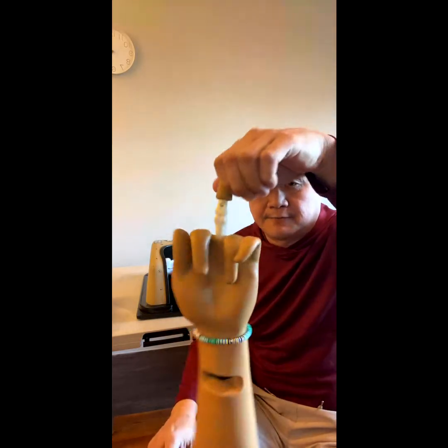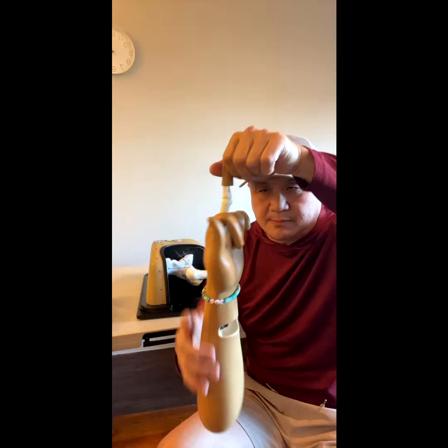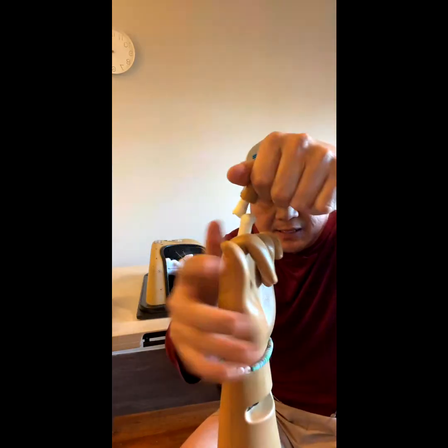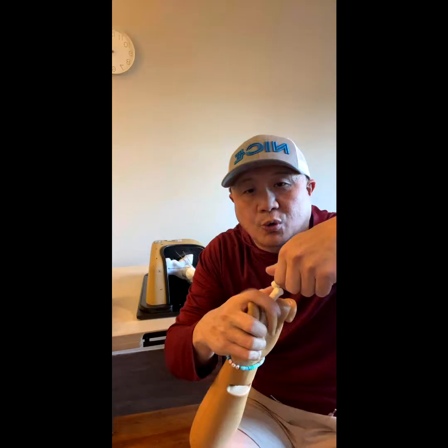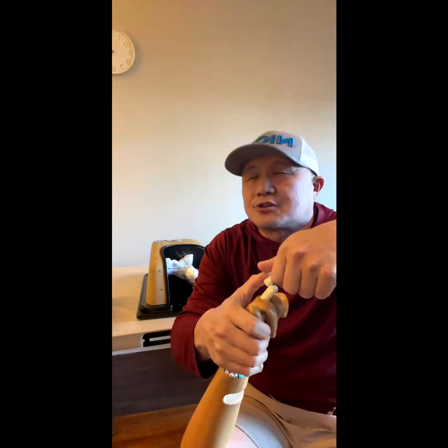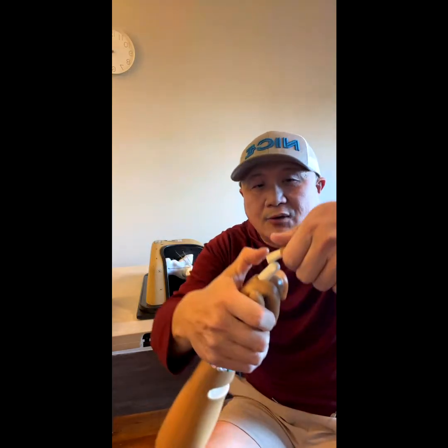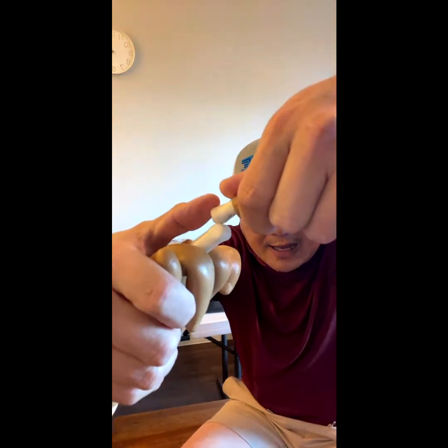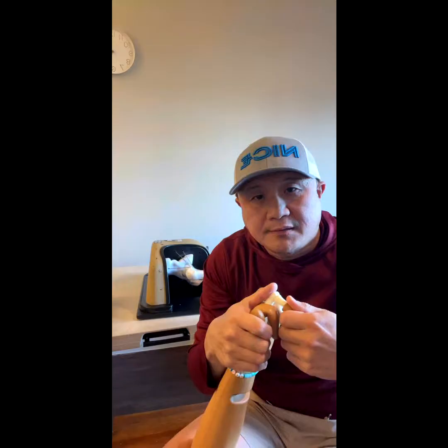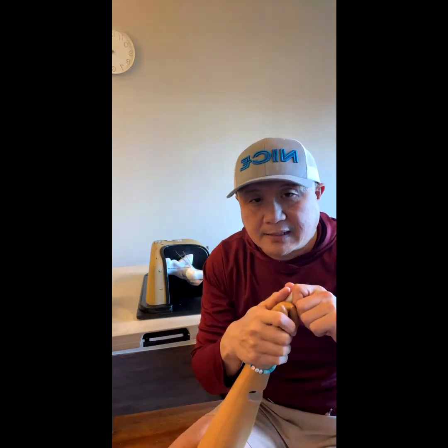Again — finger dislocation simulator. This can simulate dislocation, but you also have to learn how to hold a certain part of the body and how to apply pressure with the push and pull. If you do that, snap — that's how you put it back.